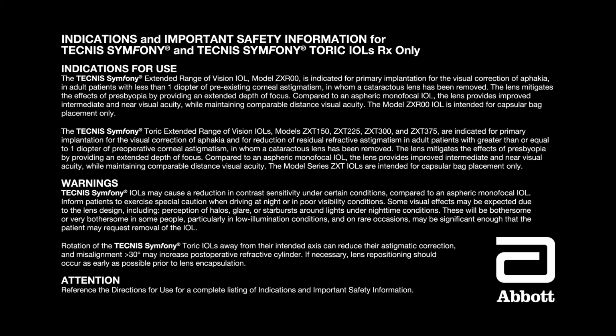Warnings. Tecnis Symfony IOLs may cause a reduction in contrast sensitivity under certain conditions compared to an aspheric monofocal IOL. Inform patients to exercise special caution when driving at night or in poor visibility conditions. Some visual effects may be expected due to the lens design, including perception of halos, glare, or starbursts around lights under nighttime conditions. These will be bothersome or very bothersome in some people, particularly in low illumination conditions, and on rare occasions may be significant enough that the patient may request removal of the IOL.